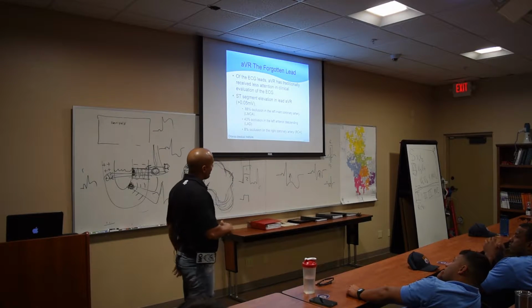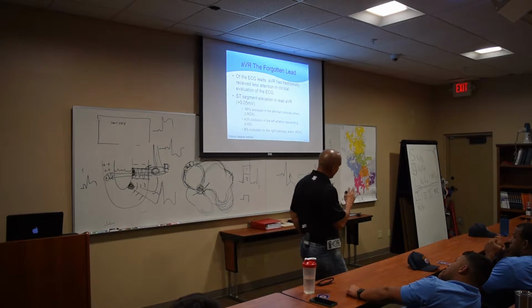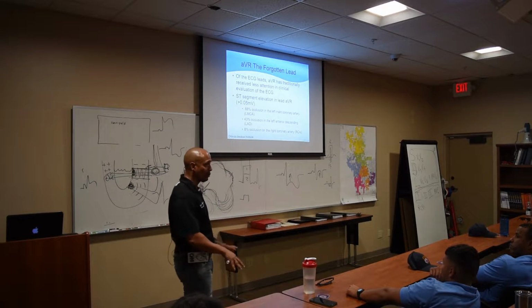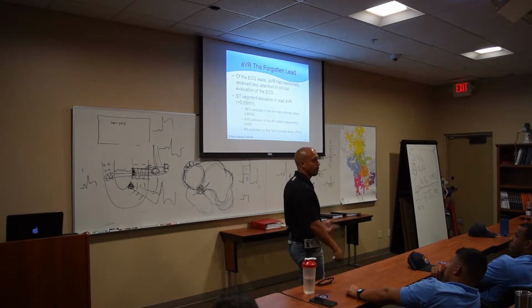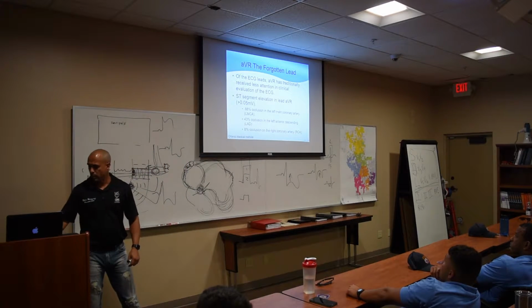So if I look at that and I say, wow, I got elevation or depression in my septal, anterior, and AVR is involved, this is a blockage where? No doubt. Where's this blockage located? Left. This is the guy who's got one foot in the grave and he's slipping on a banana peel. All right, so AVR is good for that, to determine that.